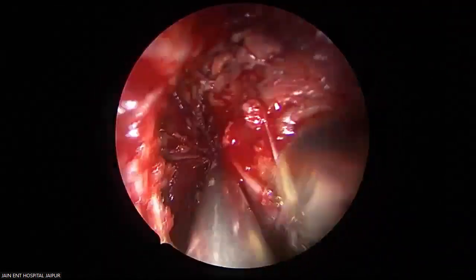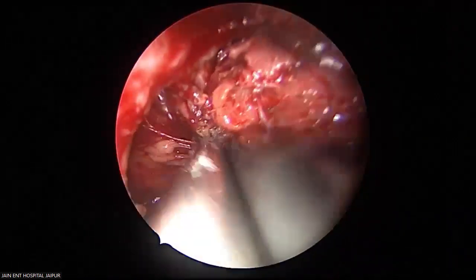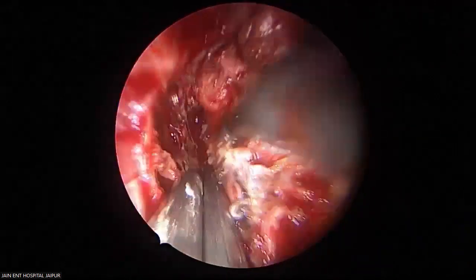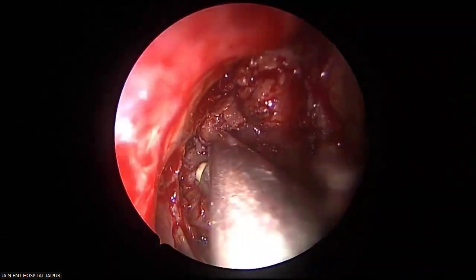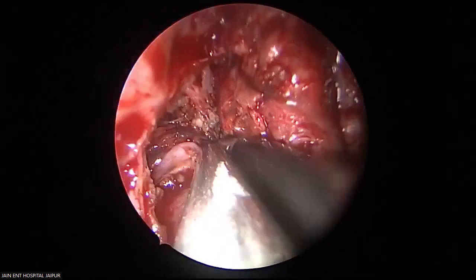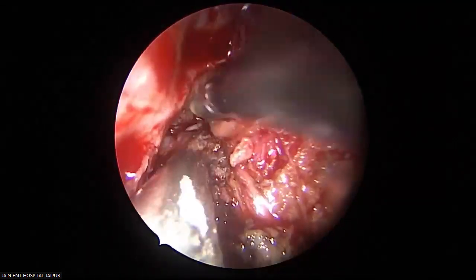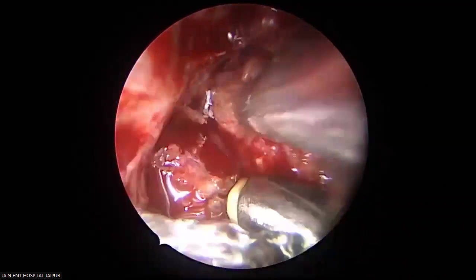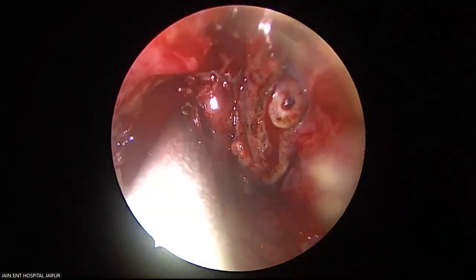Beautifully exposed basically. My target is to clip the internal maxillary artery in the infratemporal fossa. The entire infratemporal fossa is exposed, and all the possible feeders on the surface I have coagulated here. Give me a gauze piece. Just for the timing, we'll leave a gauze piece over here with this exposure.